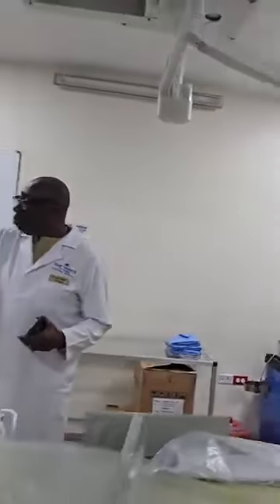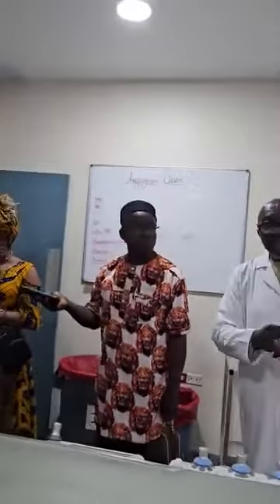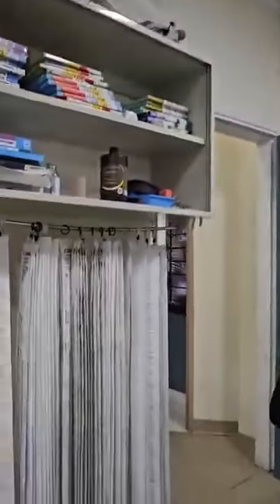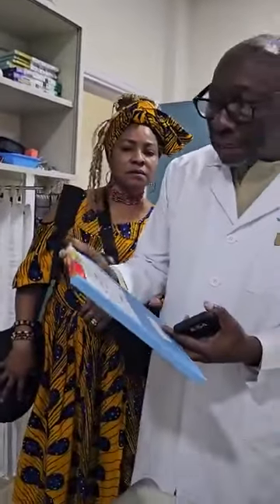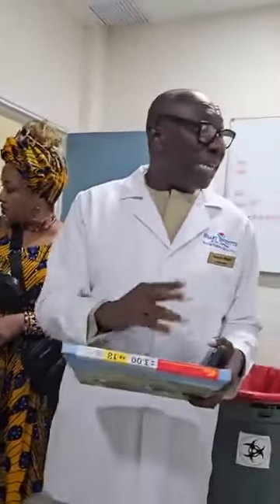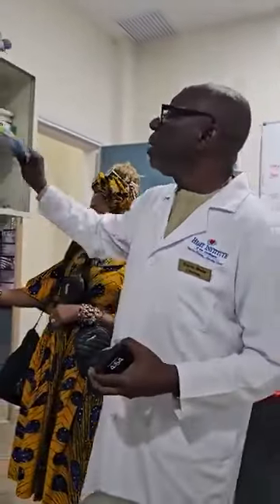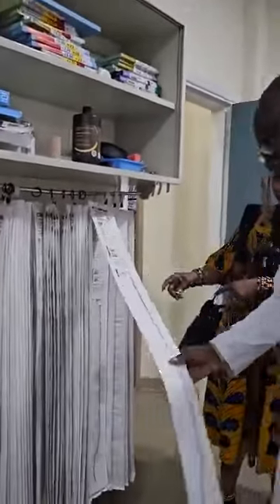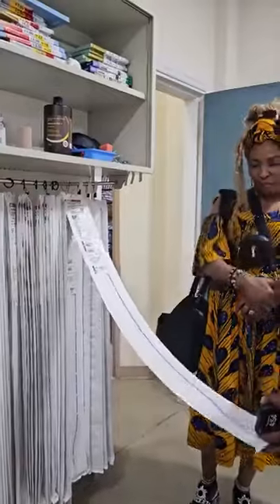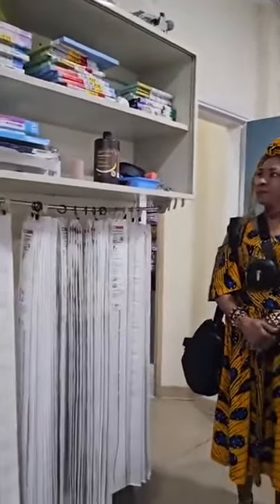We have a lot of defibrillators. These wires are what we use to do investigations in the heart. Run the wires and then take pictures. And this is what the stent looks like. When they size the vessel that has an obstruction, they open this, prepare it and then deploy it. It opens the way and the blood starts flowing to the heart. This is a catheter. This is what we use to go in through there, inject and then see.